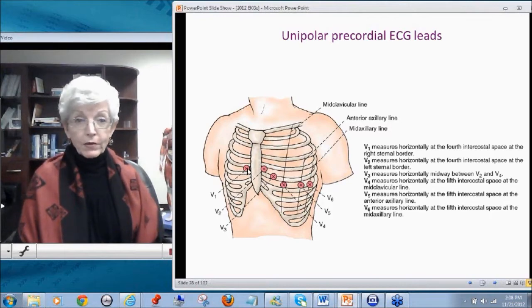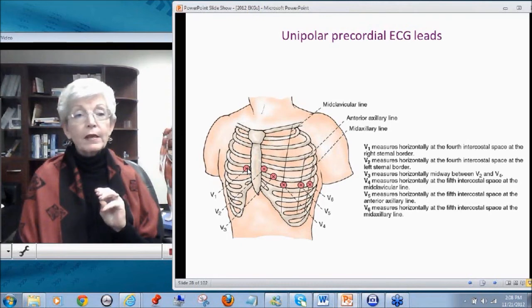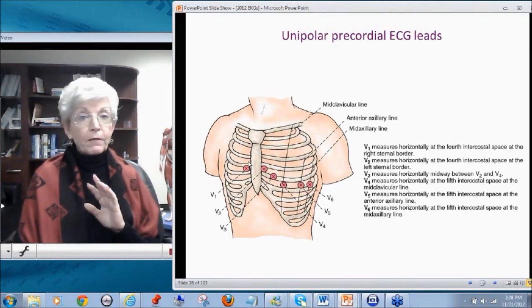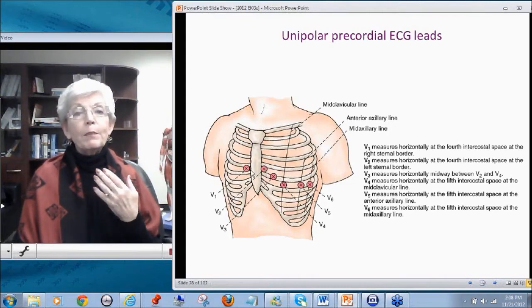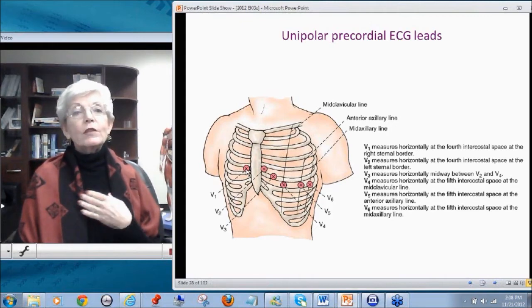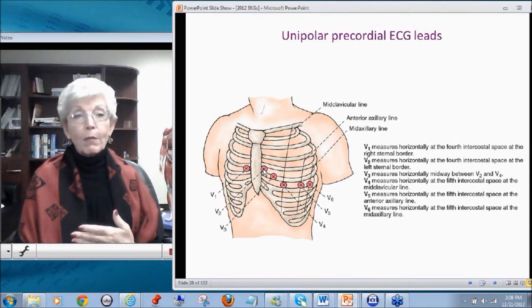On a historical note, I actually worked at Stanford University Medical Center when Dr. Norman Shumway did the first heart transplant. One of the early ways of determining rejection was a change in amplitude. But if the technician or the nurse was off in any way in the placement of these precordial leads, you couldn't compare one EKG one day to an EKG the next day, because they weren't done exactly the same. So he actually began to tattoo a little dot in the OR for the precordial leads, so that everybody would put them in the same spot.